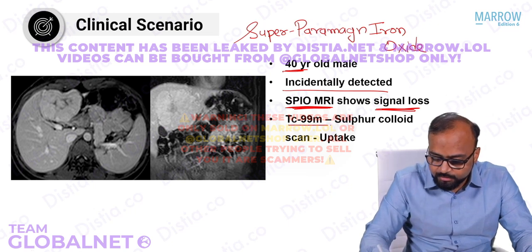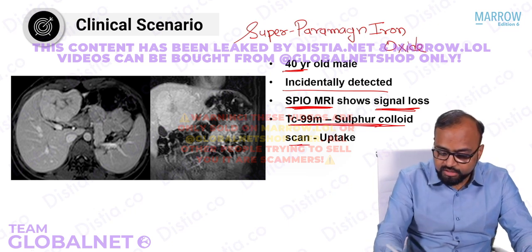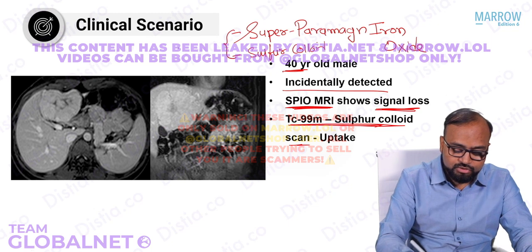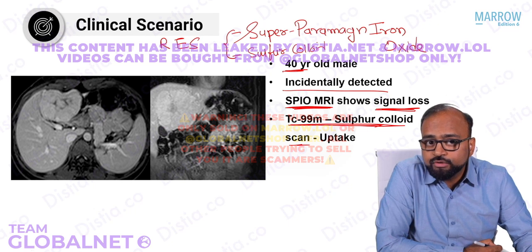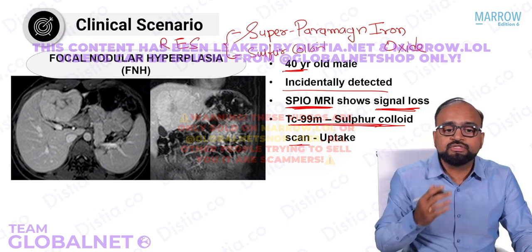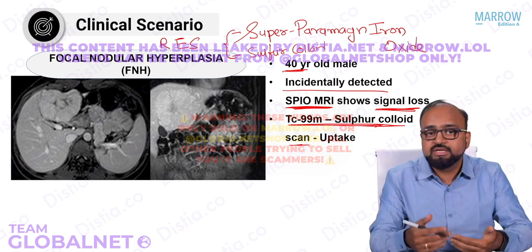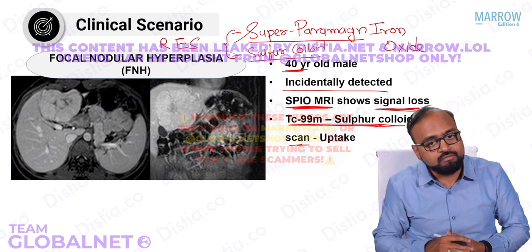Also see, technetium labeled sulfur colloid scan also shows uptake. The key here to know is that both these agents, superparamagnetic iron oxide as well as this sulfur colloid, are taken up into cells of the reticuloendothelial system. And because they are taken up into cells of the reticuloendothelial system, it means that these RES cells or Kupffer cells in the liver are present in this lesion. So what is this lesion? This lesion is a focal nodular hyperplasia. So focal nodular hyperplasia is rich in these Kupffer cells, right, of the reticuloendothelial system. Therefore this SPIO MRI is going to be taken up. Therefore this sulfur colloid is going to be taken up.